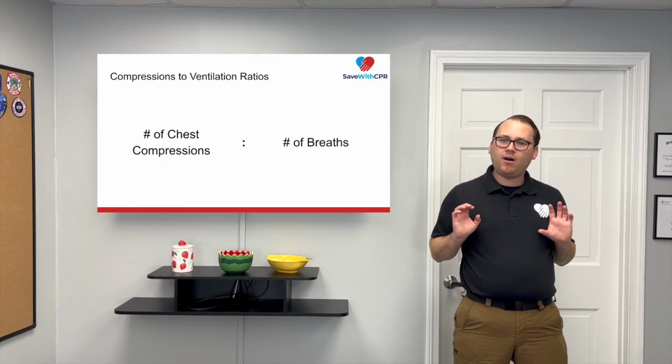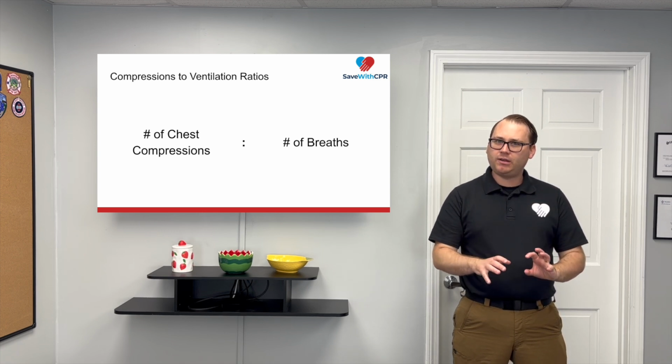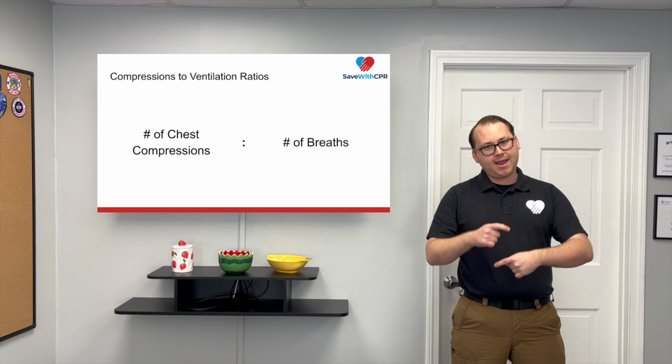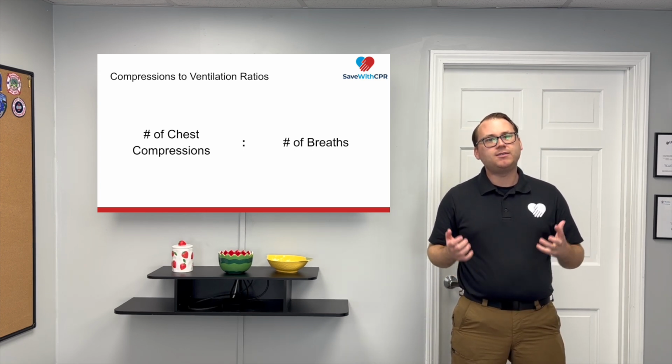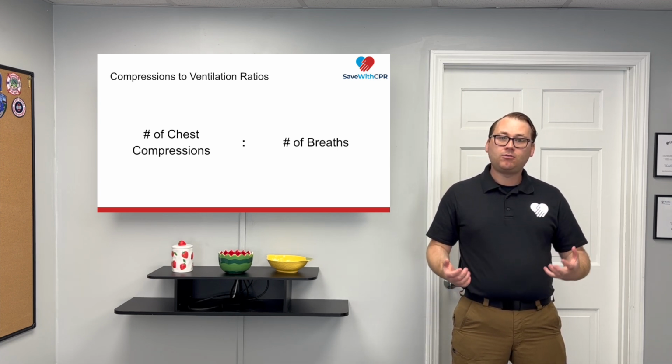We're missing a component, right? We're missing putting the oxygen back onto the blood, right? Because the cells need oxygenated blood. So by doing chest compressions, we're circulating the blood. By putting the AED on the patient, we're attempting to restart the heart. The missing component is putting oxygen back onto the blood. We do that with rescue breathing, right?